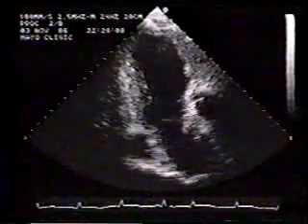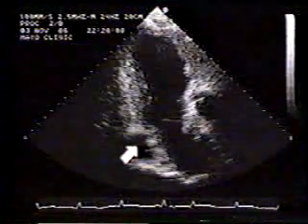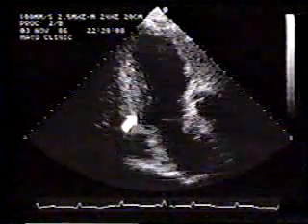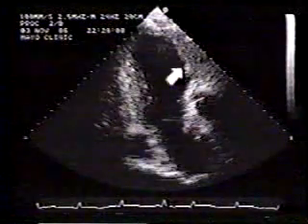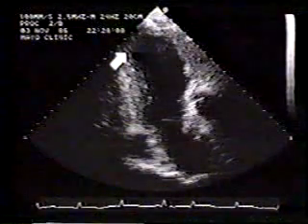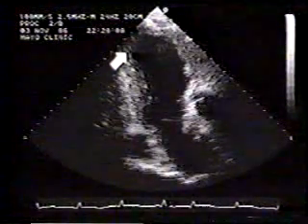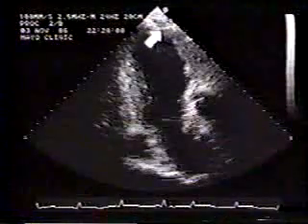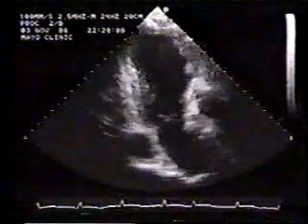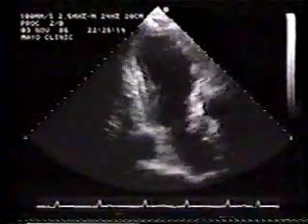The transducer has been further rotated to the apical two-chamber view. This is the descending thoracic aorta. In real time, the inferior wall will contract normally at the base and mid-levels. The anterior wall and the infraoapical segment will be markedly dyskinetic. Remember that the LAD not only supplies the anterior wall and anterior septum, but also usually hooks over the apex to supply this infraoapical segment. Based on all views, the score index for this large anterior infarct is 2.4.